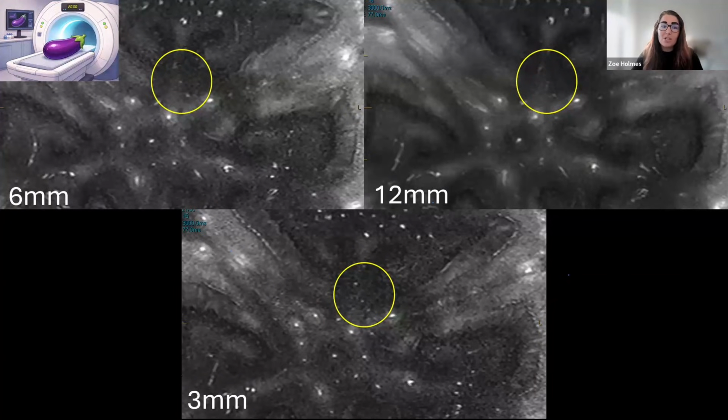So the practical recommendation is to use slice thickness as a rescue knob when the clinical question tolerates it, especially when you're dealing with motion-limited or low signal to noise ratio situations. If the clinical question depends on thin slices, then don't pull this lever. Find your signal to noise and earn it back in other ways, like coil optimization, modifying your averages and NEX, and reducing any unnecessary acceleration to gain that signal back instead of going straight for the slice thickness.